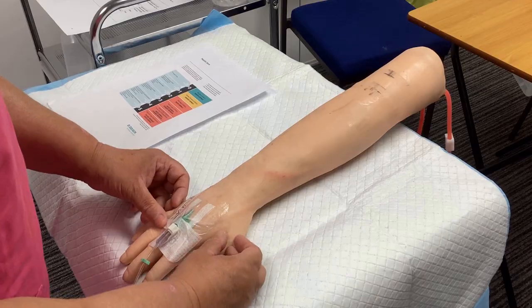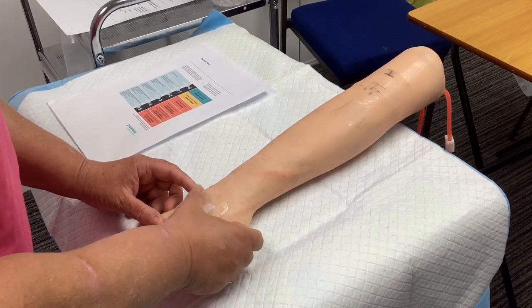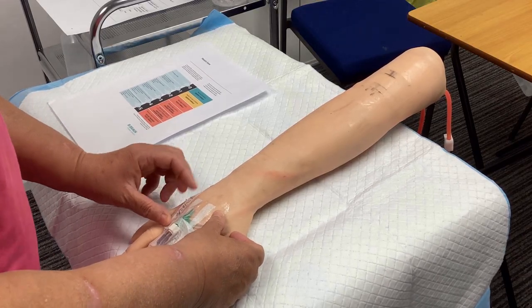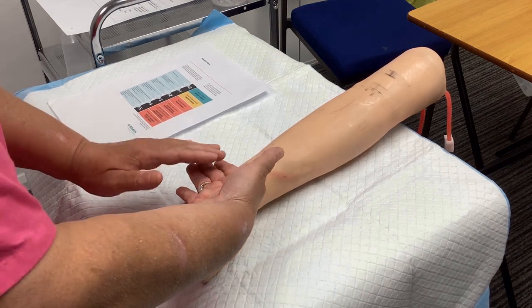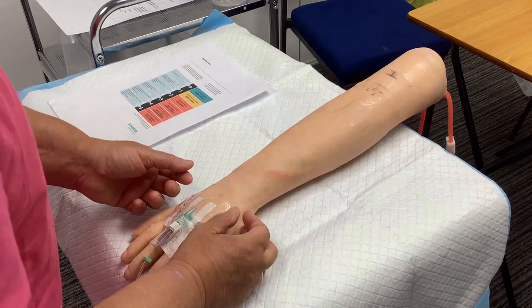And then I'm observing the site. I'm looking for any redness, any swelling around the site. There does not seem to be any redness or swelling, and then I'm just going to touch the site just to feel if it feels warm as any indication of infection.